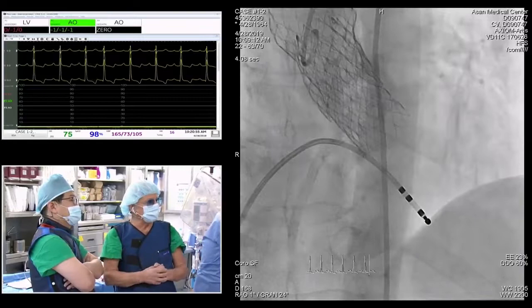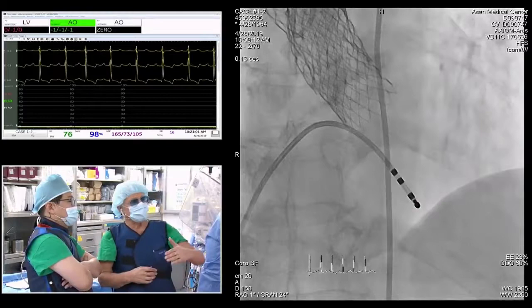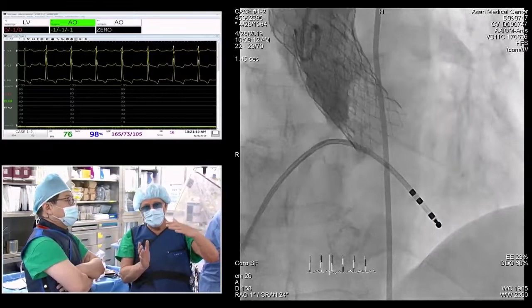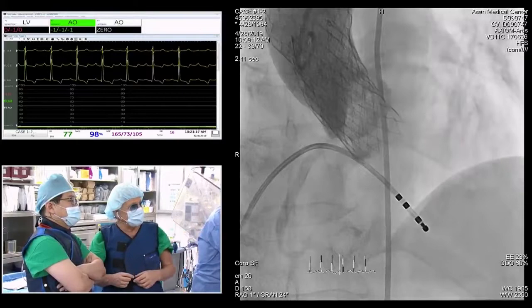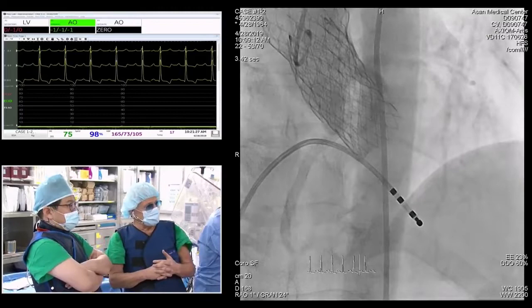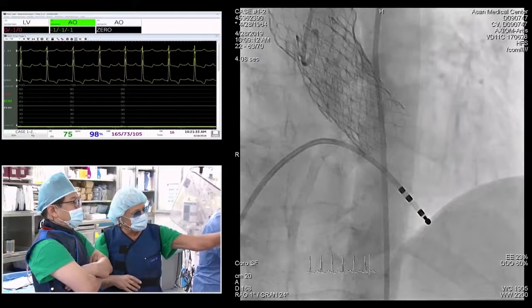As you said, and if you heard Greg, the question was pulling the previous valve up. First of all, the valve did move up by itself a little bit, so it left a space between the wrap of the first and the leaflets. The leaflets, as you can see here, move in our favor, and we were able to get into the space. You can see the sinus is narrow, but there's no obstruction and there's good flow, both on the right and on the left side. The right coronary looks good, well perfused. The left side looks perfused too.